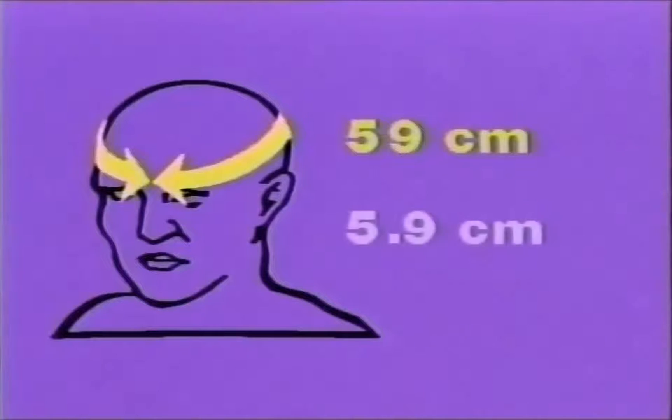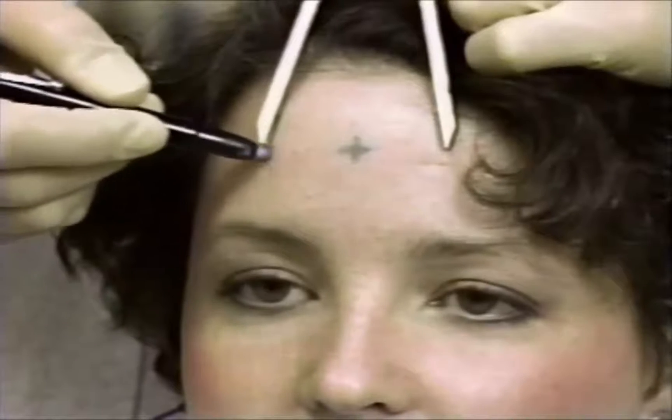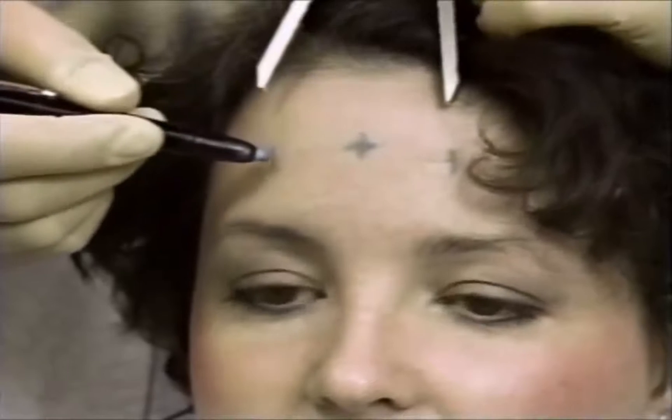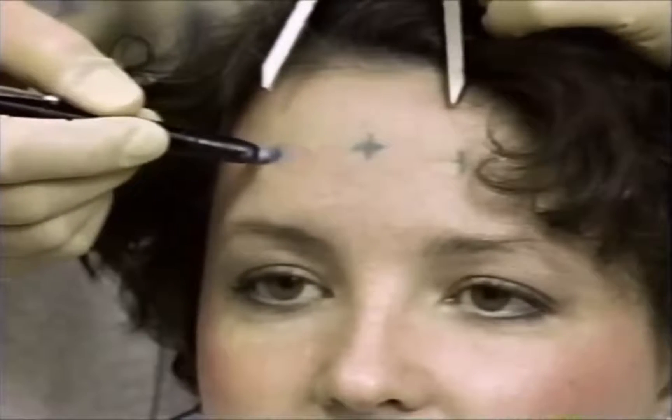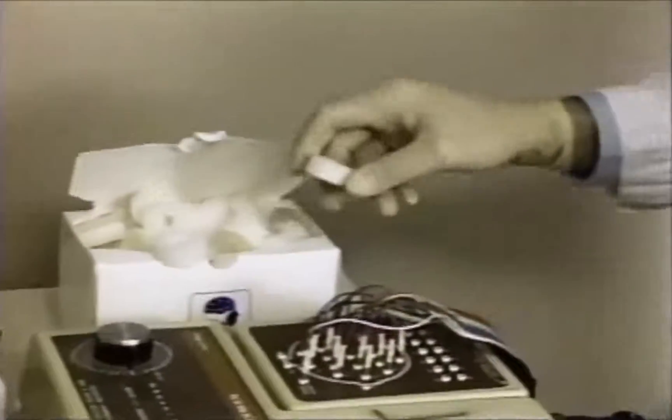A similar procedure is used to find the placements for the FP1 and FP2 electrodes. The noted head circumference of 59 centimeters results in a measurement of 5.9 centimeters. Calipers are expanded to this measurement and placed evenly between the middle; marker lines are drawn vertically and horizontally on the extended FP line.